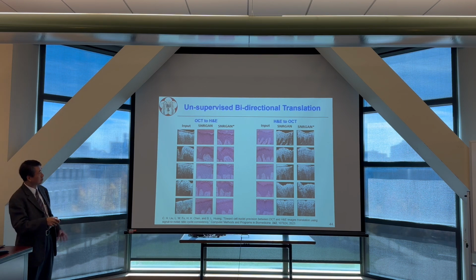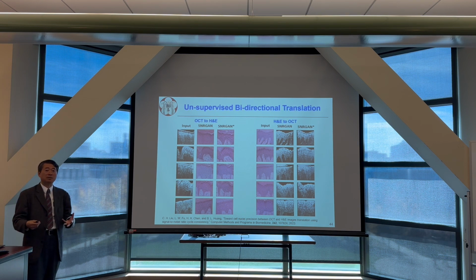But those information from the HE stain, it's very easy. The physician can recognize it. So if we can translate the HE back into the OCT, maybe it can help us in the future to try to read those special cells.